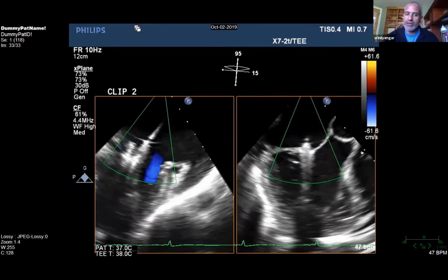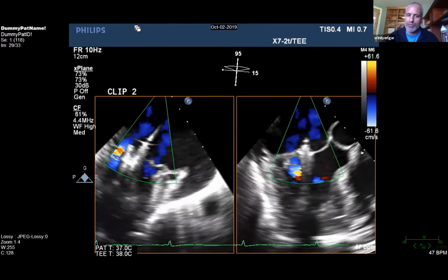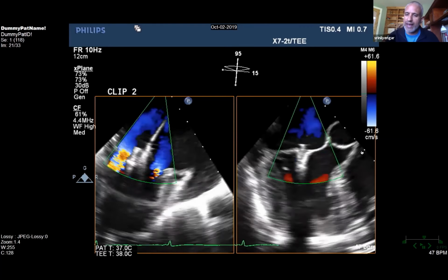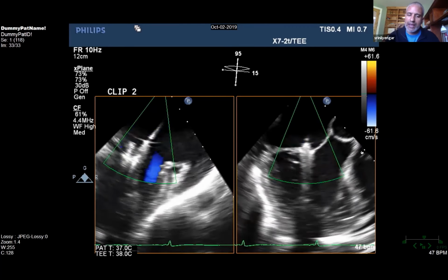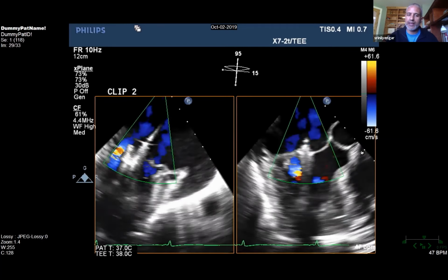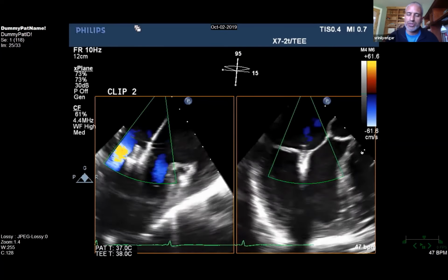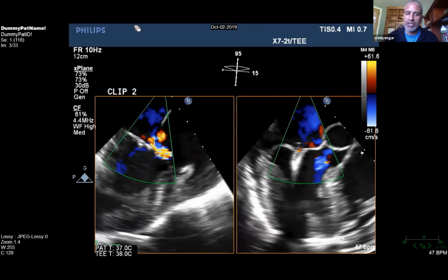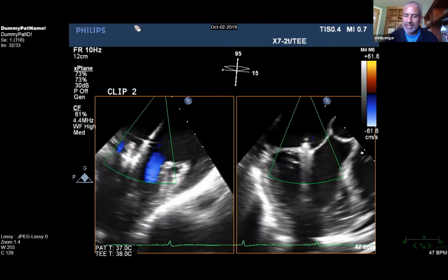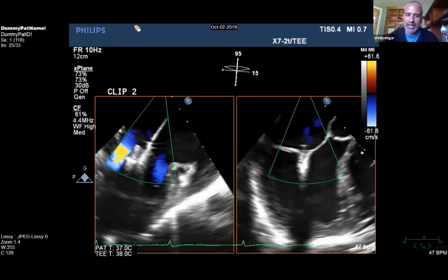Now, the thing here is the gradient was only approximately 3 to 4 at this point, and we still have that jet that you could see there past the lateral aspect, and we could have actually moved for a third clip. However, I feel it's important for all operators who are watching to understand that we don't just treat color, but rather we utilize all types of variables in deciding to place another clip, including how the color looks, but also how is the gradient across the mitral valve. Additionally, is there hemodynamic changes that can be visualized?